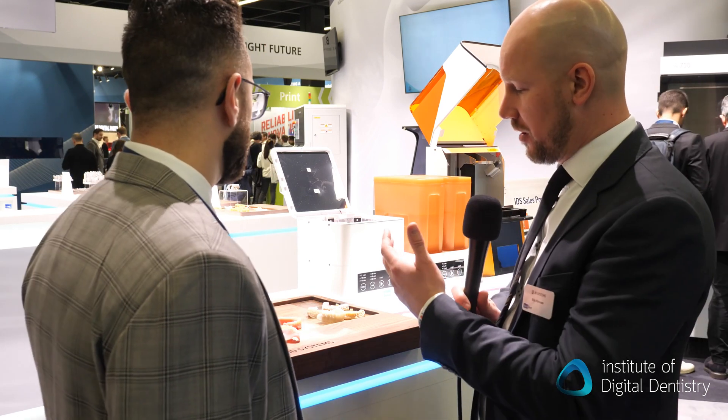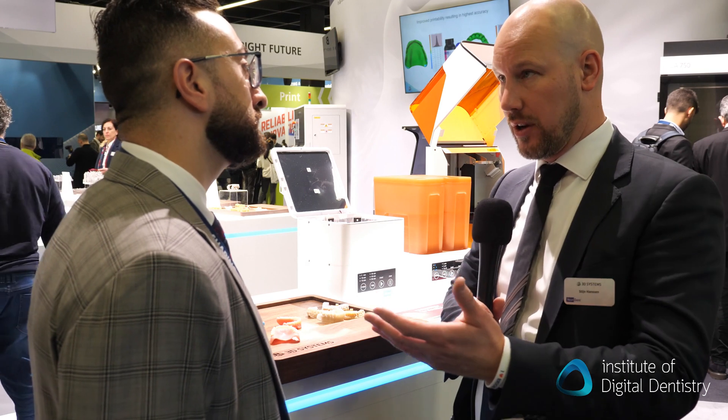You guys have really opened up. We are opening up in a lot of ways. We want to also validate our resins on different printers that are available in the market. So we have partnerships, for example, with Acureta.